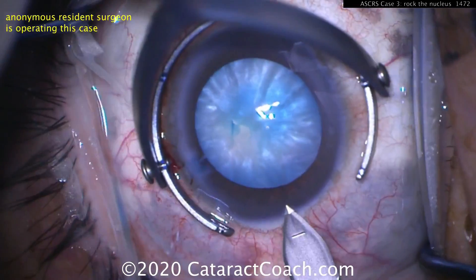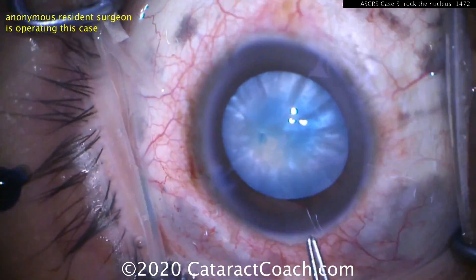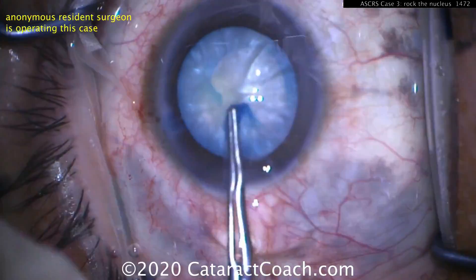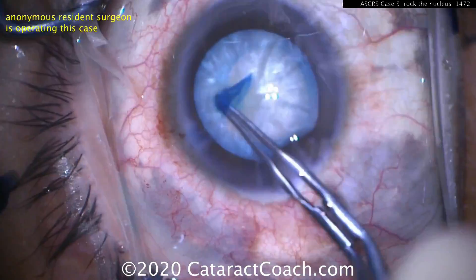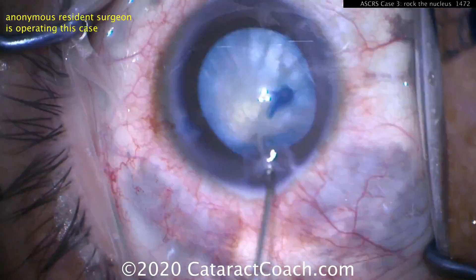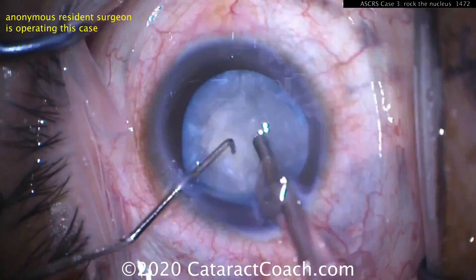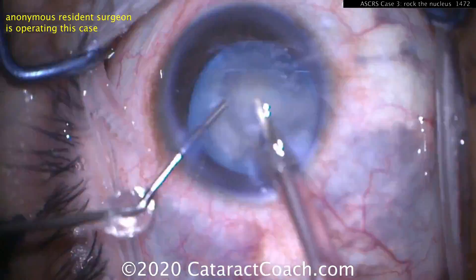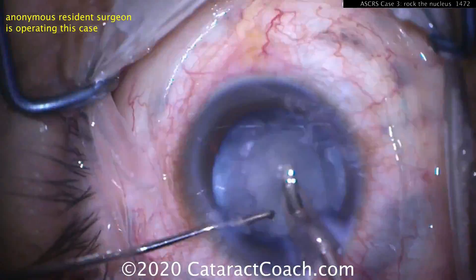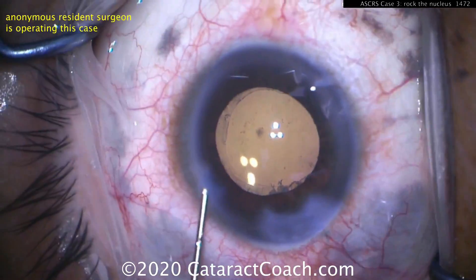Now you can see this resident will do a nice job making an incision, and the rhexis can be completed with a lot of control because the capsular bag is completely depressurized. At this point, the rest of the case is pretty normal. You've got good technologies, good tools, and good ideas for techniques on how to do these types of cataracts. This resident is doing a beautiful job with that phaco chop, which is going to be another one of our videos you can learn as well. Keep these tricks in mind for rocking the nucleus when you have an intumescent white cataract.